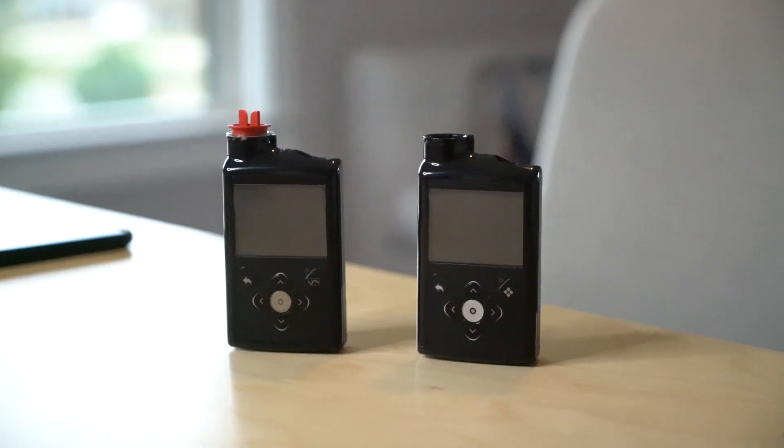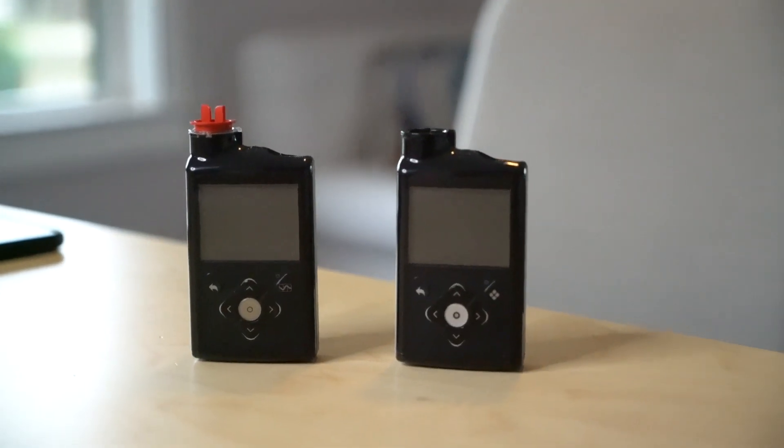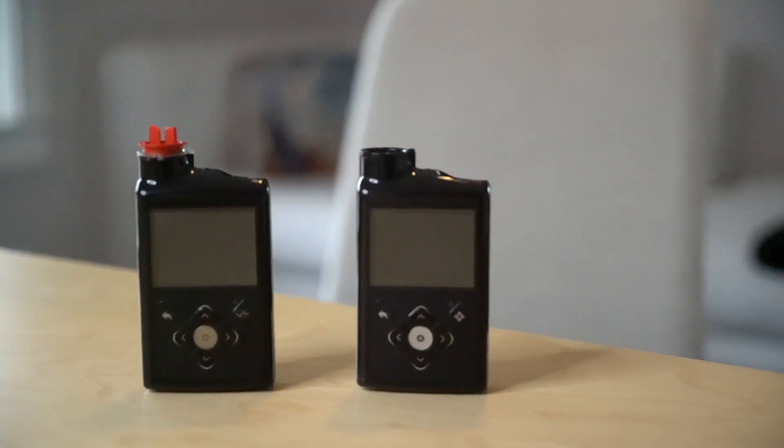When you look at the physical pump, I've got the 670G here and the 770G right here. It's almost identical in nearly every way. You can see it's got the same configuration, the same sort of casing and shape, same size and weight, same battery. Let's talk about some of the operational differences between the 670G and the 770G.